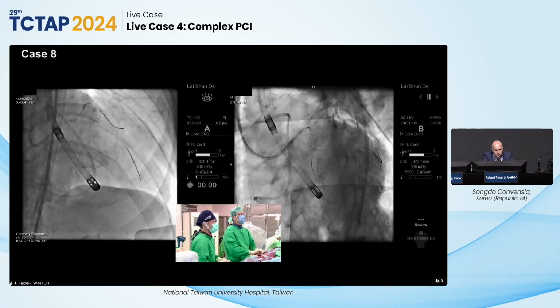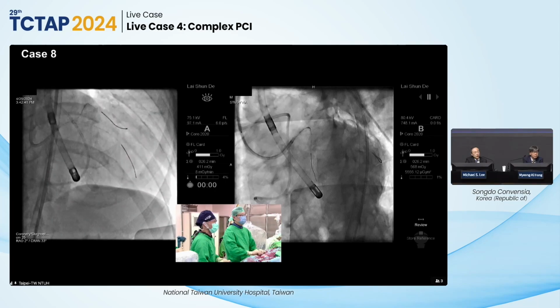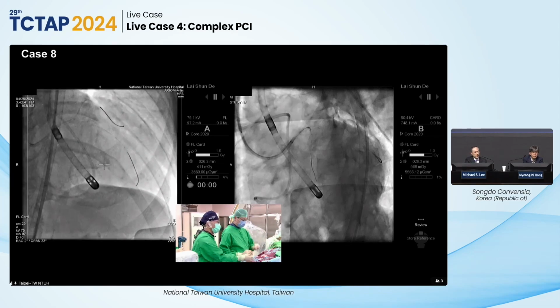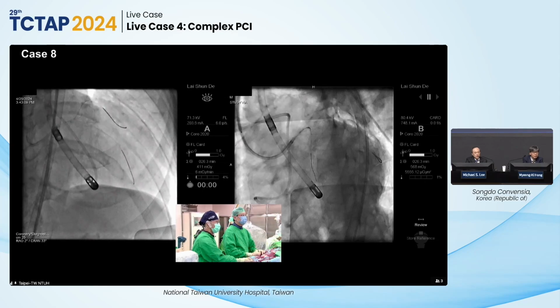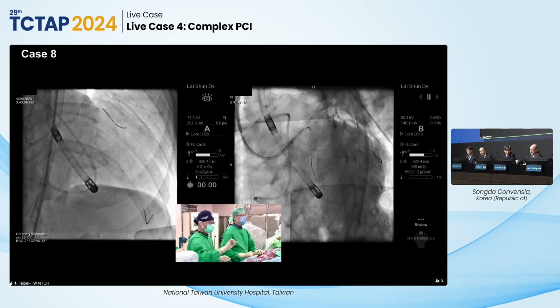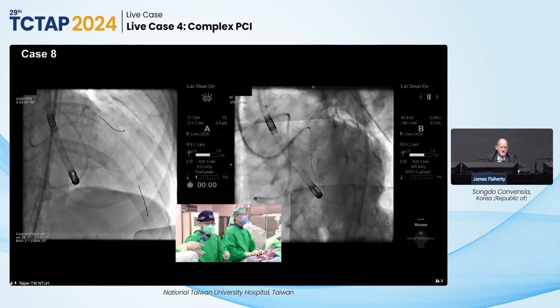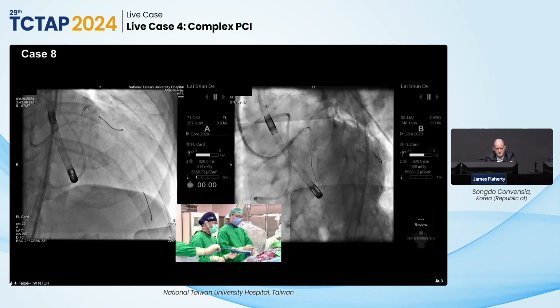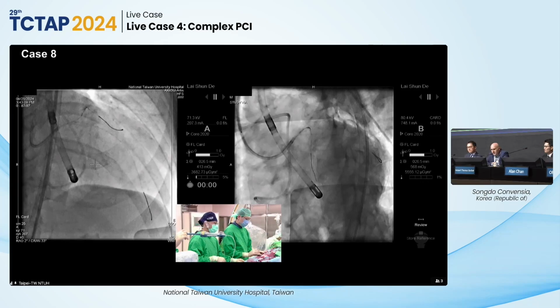You know, with the left main disease, the other option would be to put a buddy wire into the LAD, just because when you start advancing guideliners with left main disease, with questionable myocardial reserve, maybe just try conservative. Yeah, or you could IVL that one segment. It looks fairly calcified where it was getting stuck. I don't recall what the IVUS showed, but there's a chunk of calcium at the distal left main. The flow's looking a lot nicer though, isn't it? I think that's a nice thing to see, that the more work you're doing, the LAD's picking up and you're seeing more blush distally.